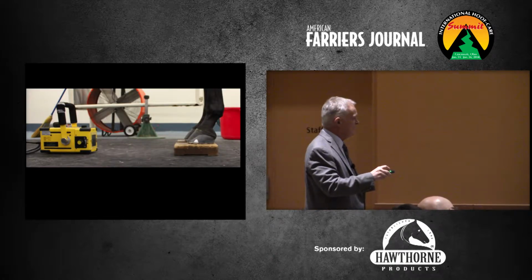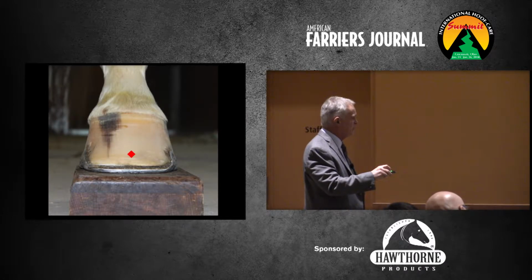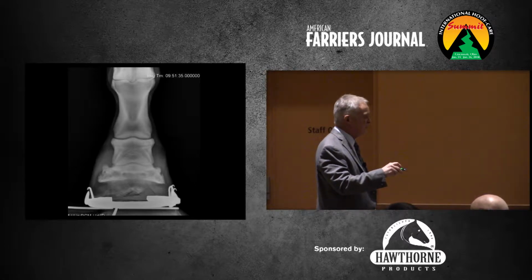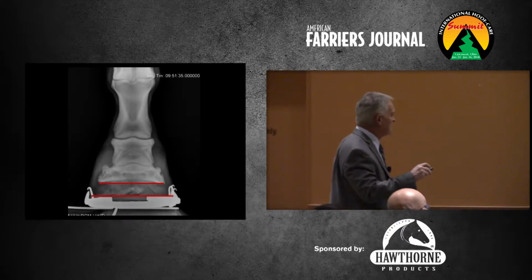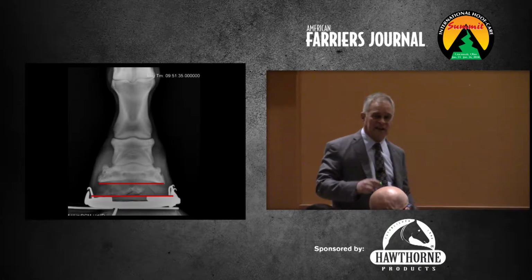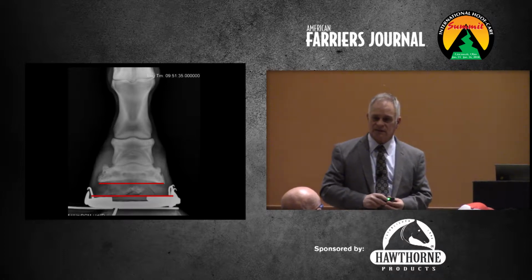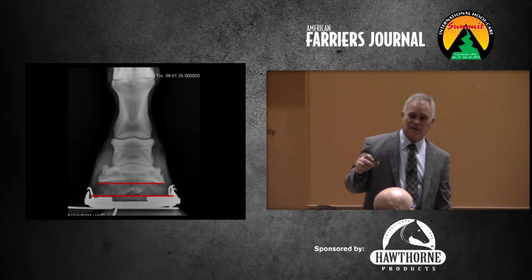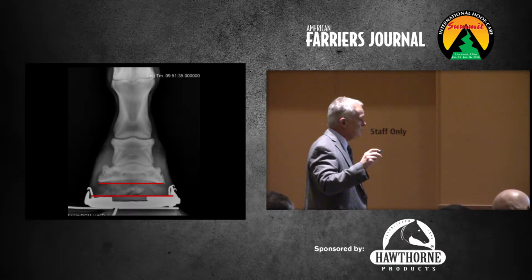Okay, for that DP or the front to back, again, same thing, 3/4 of an inch above the hoof wall, straight through. What we're trying to do is sight right through the bottom of that coffin bone, and this is how we can judge medial to lateral balance the best. You can draw the lines. Obviously anybody in here could make a degree or two different. We're not really worried about that. I'm not going to argue about that. It's just to help you say, okay, it looks pretty balanced to the ground, standing, loading P3 appropriately. All right, any questions on those?